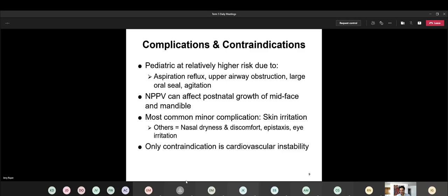So what I used to do, and I think a lot of other therapists probably did the same thing, is anytime you place one of these masks on and you try to get it positioned and secured, take your hands and feel around the mask to see if there is leaking. You expect a little bit of leaking, but if you feel a lot of leaking, and if it's right around the eye region, you're going to have to do something differently and readjust so they don't end up with eye problems.